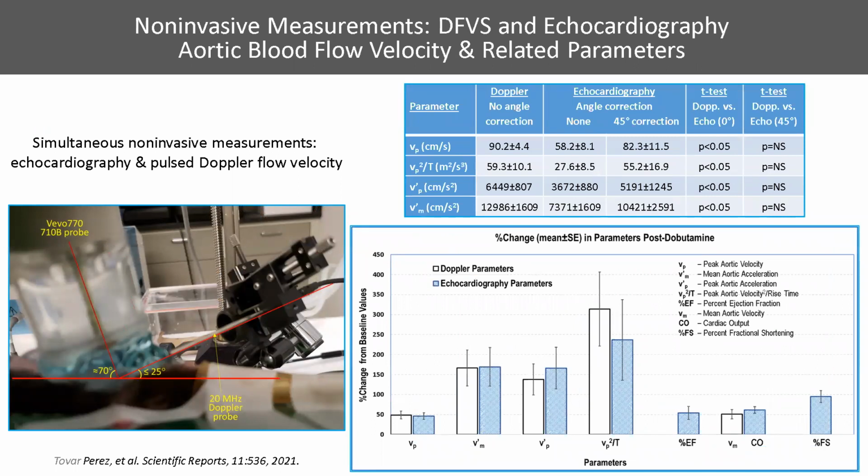And one of the things we also thought was that we have non-invasive methods like echocardiography. So why not use that? We already measure this to get our contractility measurements using dimensions and things like that. So one of the issues would be that if you were to do echocardiography measurements, you will be limited to fewer usages.